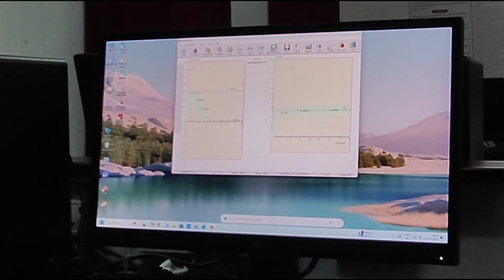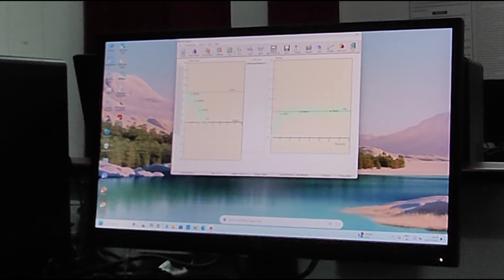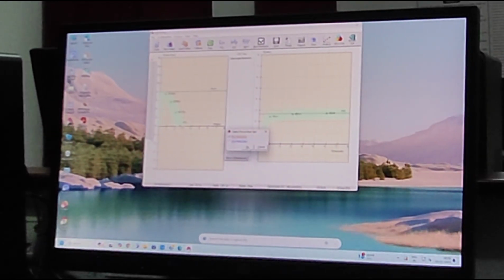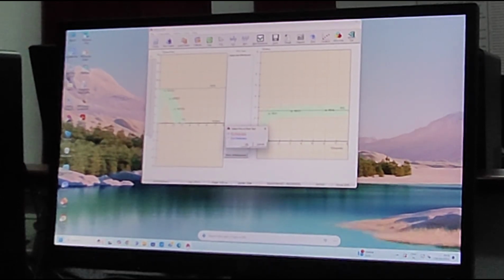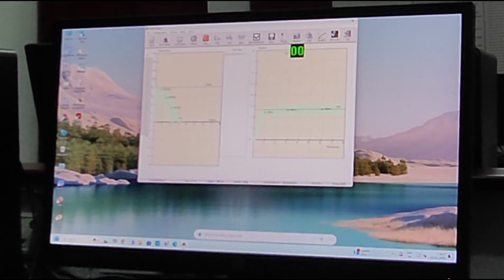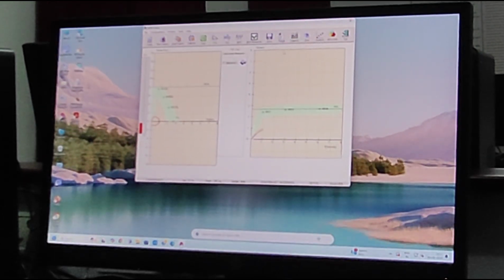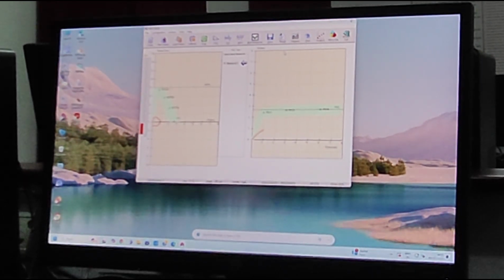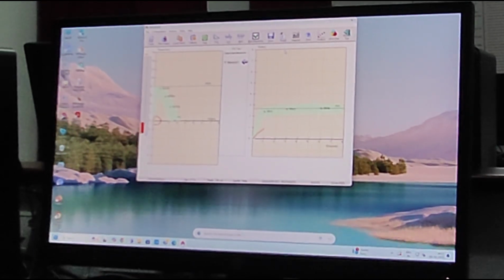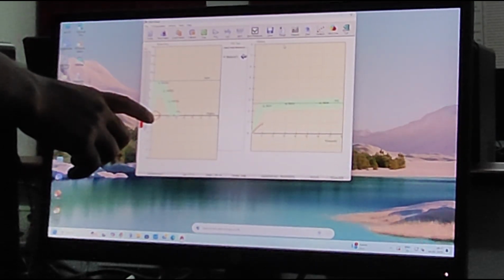For the first test, we need to click the first test, and once it has started, we click pre-medication. After the pre-medication, the test will start. Based on the air delivered by the patient, we will get the response and it will be recorded.